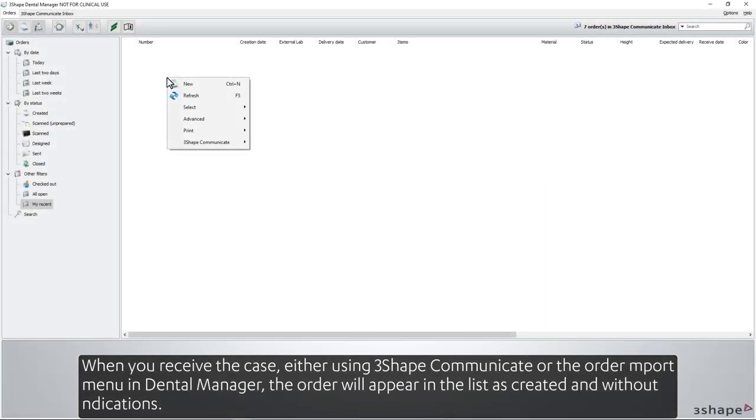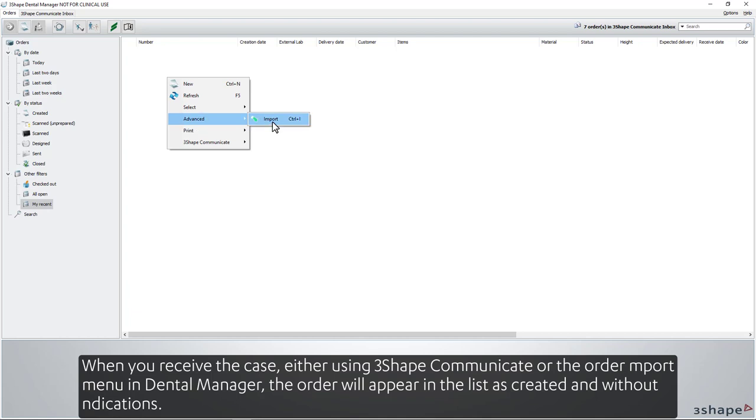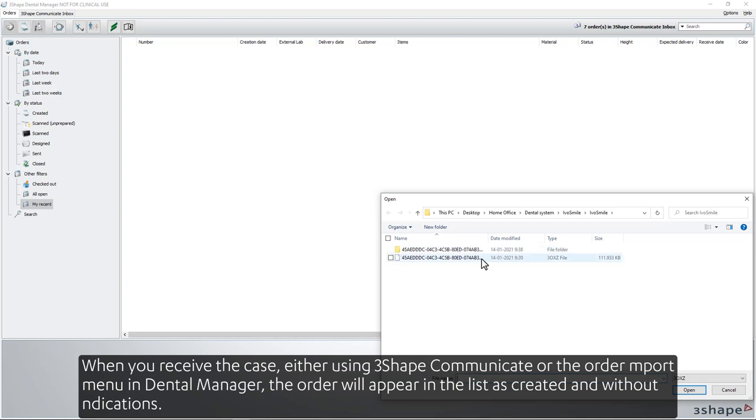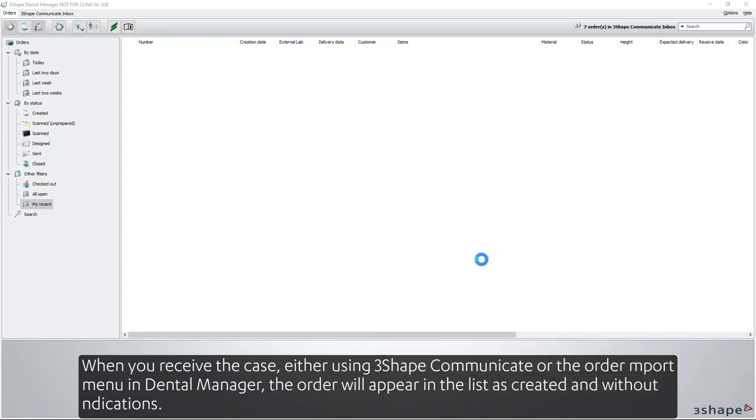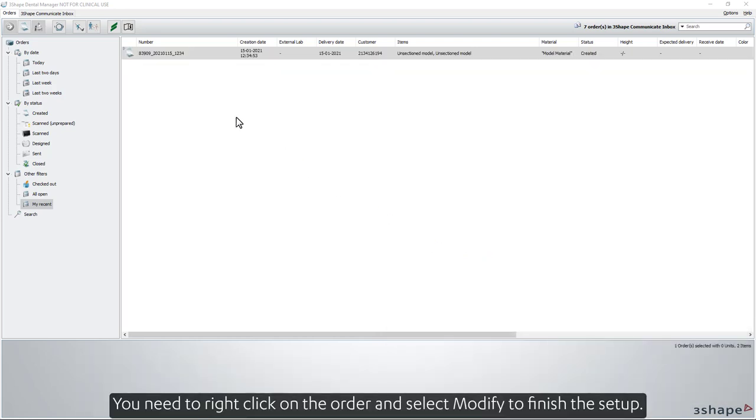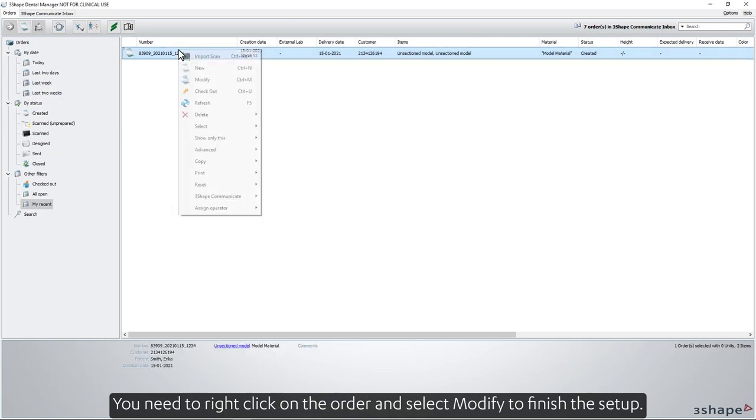When you receive the case, either using 3Shape Communicate or the order import menu in Dental Manager, the order will appear in the list as created and without indications. You need to right-click on the order and select Modify to finish the setup.